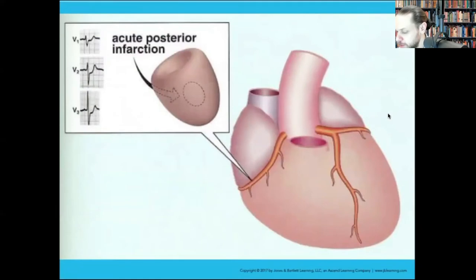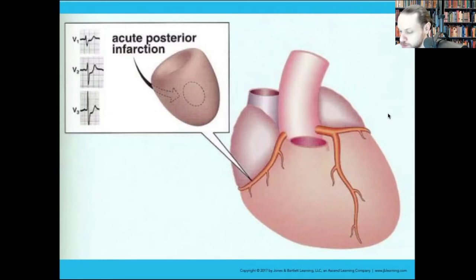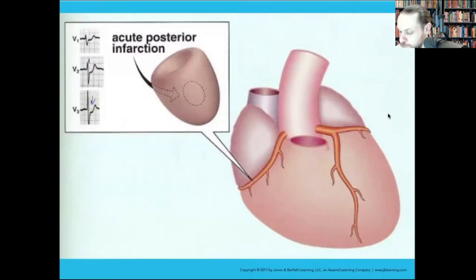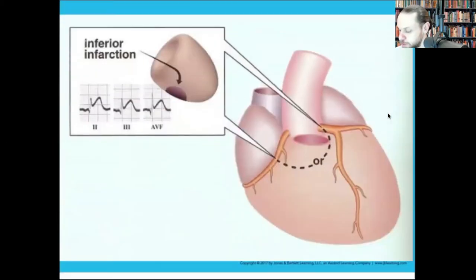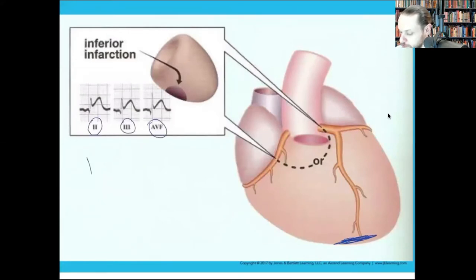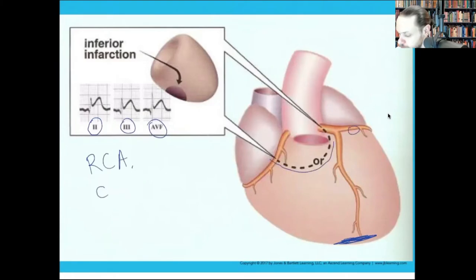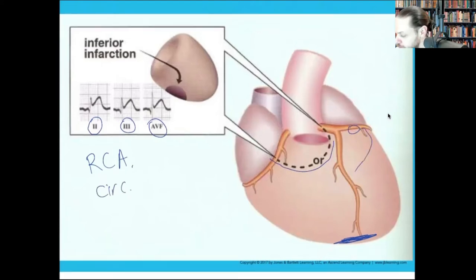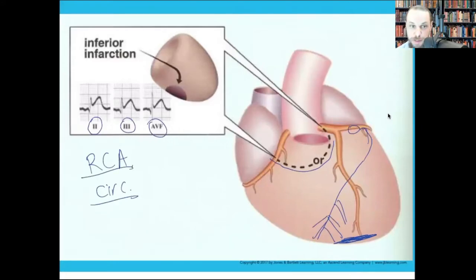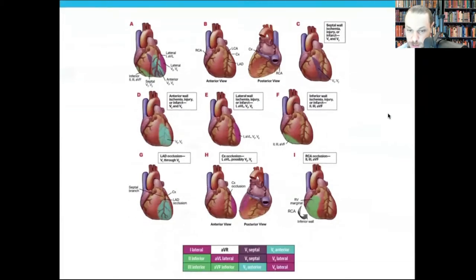Posterior wall infarction is usually manifested as ST depressions in V1 and V2. The inferior wall — leads II, III, and aVF — usually involves the right coronary artery, but the circumflex can also be involved because it comes down and can feed the inferior wall.